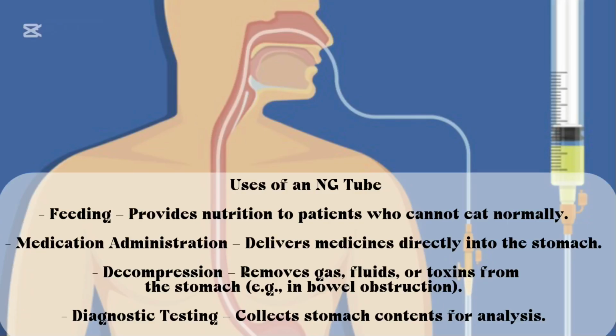Uses of an NG tube. Feeding, provides nutrition to patients who cannot eat normally. Medication administration, delivers medicines directly into the stomach. Decompression, removes gas, fluids, or toxins from the stomach, for example, in bowel obstruction. Diagnostic testing, collects stomach contents for analysis.